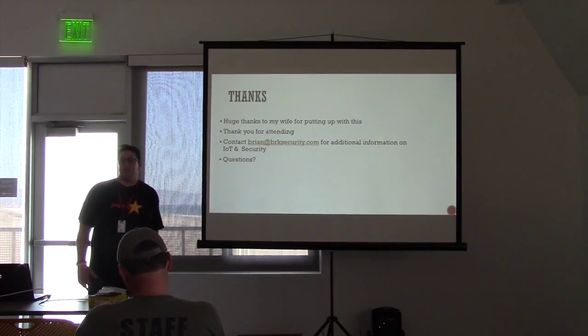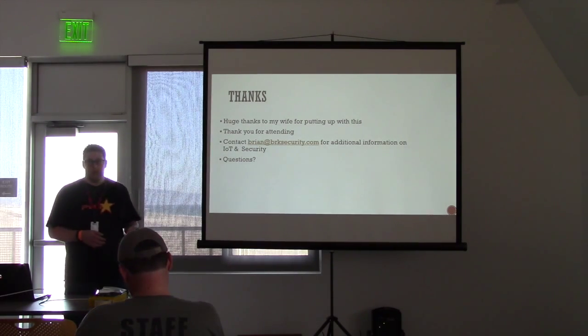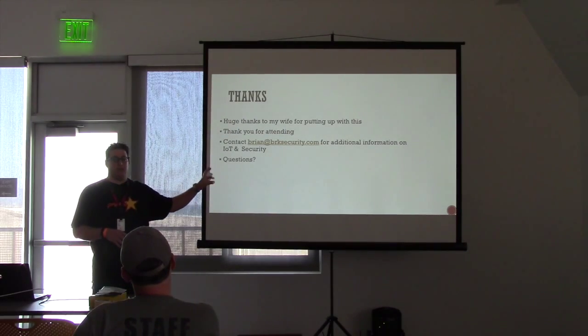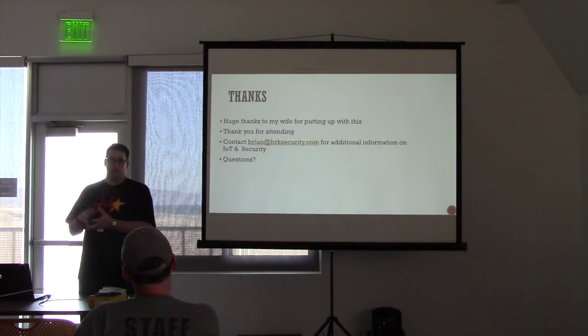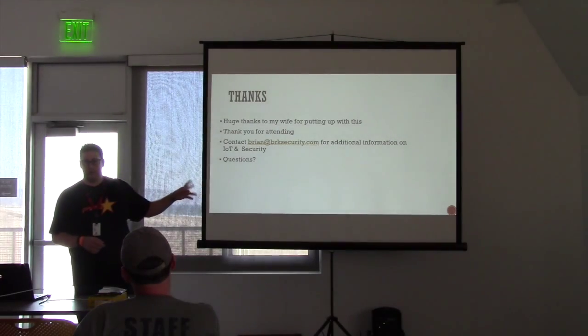Yeah, so it's a good point. So I'm not a medical expert by any means. I've tested embedded networking devices, but the people that I've talked to who do medical devices and specialize in it, what they'll tell you is that the FDA is a little tricky in this. If it is an unintended consequence of an intended feature, and I know it's really weird, but for this particular device, think of it as the intended feature here is electrical stimulation of the nervous system to block pain. So the unintended consequence would be someone jacking up that pain stimulation very high. And because that's the unintended consequence, they protect this device against that.